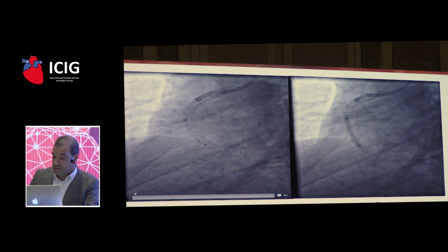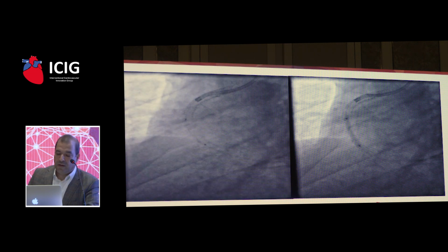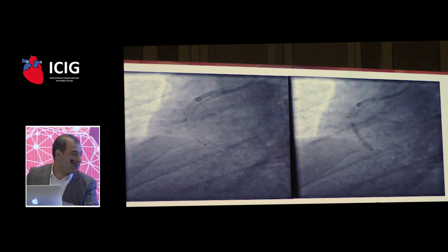It's hard to really tell, I mean, without an IVUS, I think stent boost is not enough. Well, I agree with you. I didn't have an IVUS, but with measurement of the struts of the stent, an 18 millimeter stent cannot be crushed in two parts. You will see a very small part of 2 or 3 millimeters above, and the other is down. Well, I had like 8 millimeters already placed underneath the previous stent, and that was measured clearly in the cath lab.